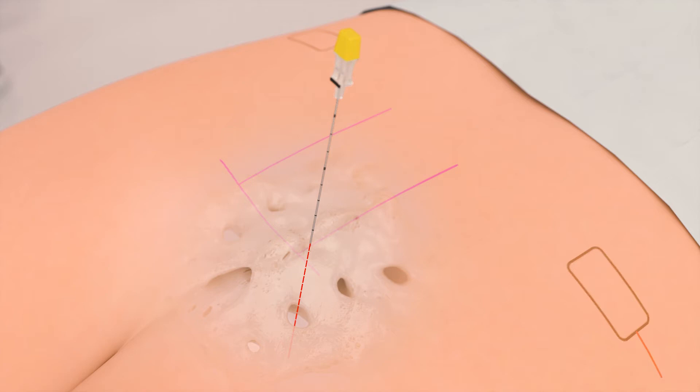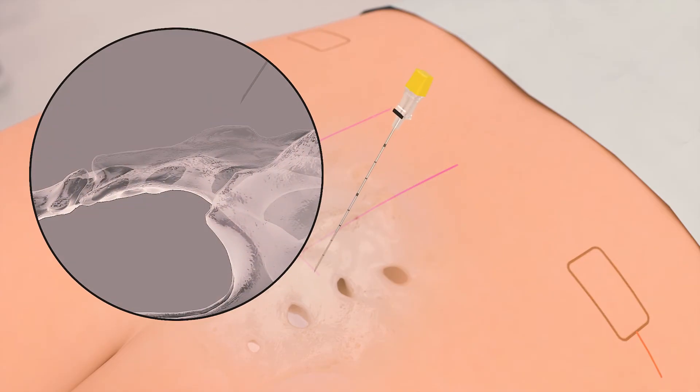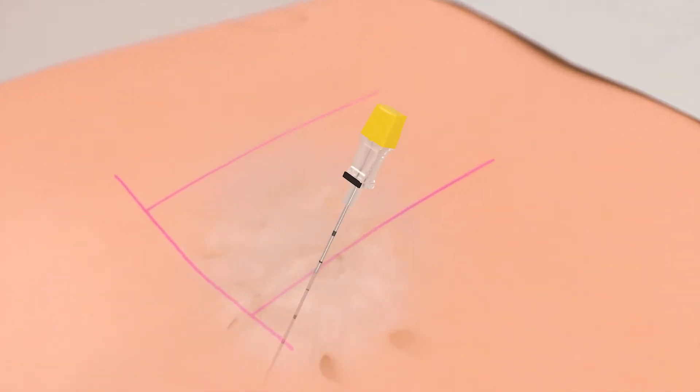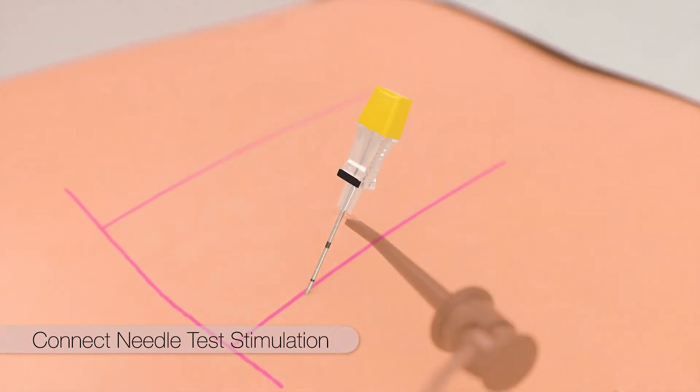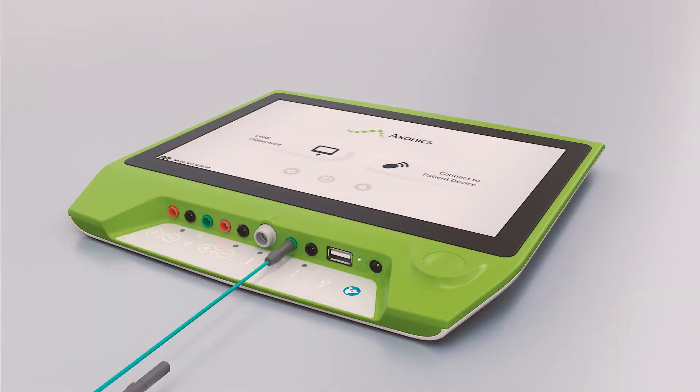Once the foramen is accessed, gentle movement is used to advance the foramen needle such that the tip of the needle is located just at the anterior surface of the sacrum. The needle test stimulation cable is clipped to the uninsulated portion of the foramen needle and the other end of the cable is connected to the clinician programmer.